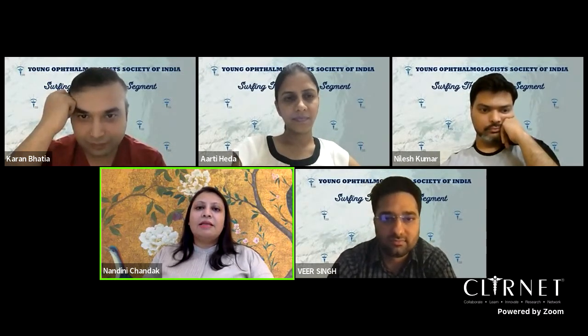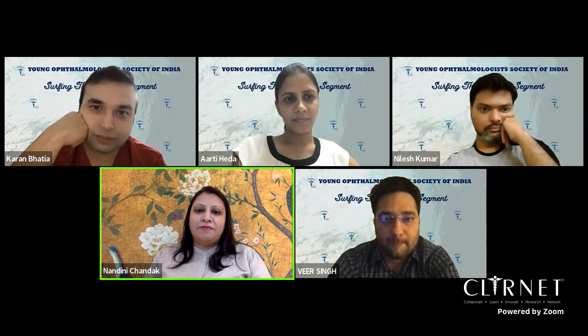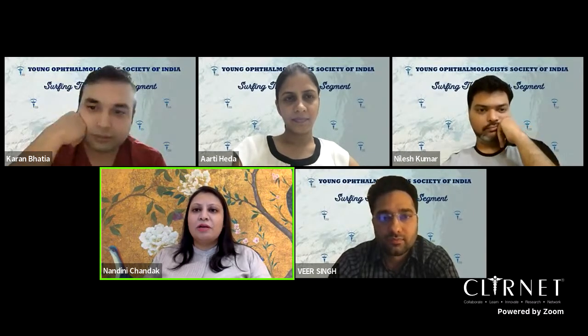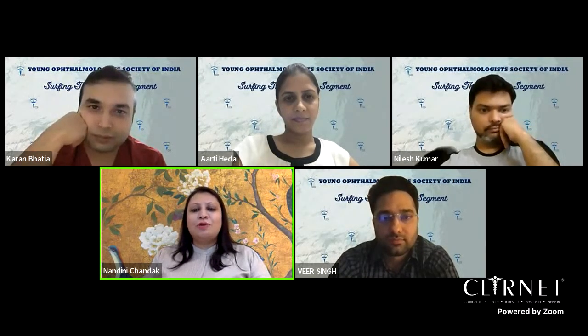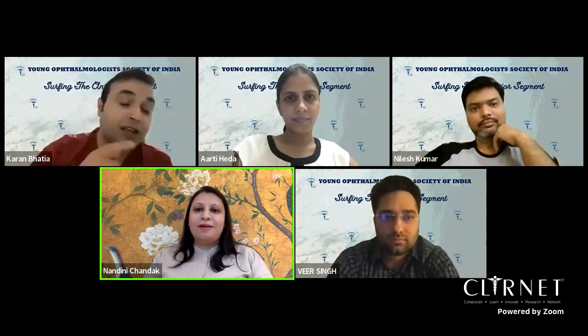People think that the iris claw lenses would de-enclavate, but really if you have done the enclavation properly, which again is in the mid periphery, it doesn't de-enclavate that easily. And I think we all are doing iris claw lenses. So it is much easier to do that than an ACIOL. I don't know how many of you agree with me.